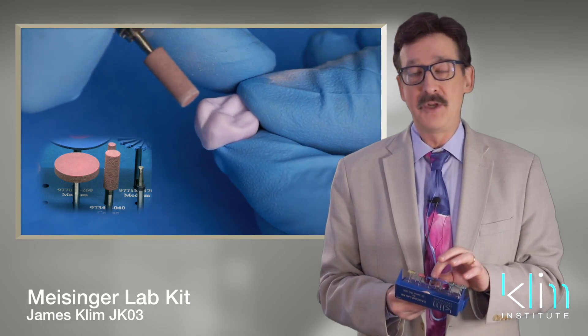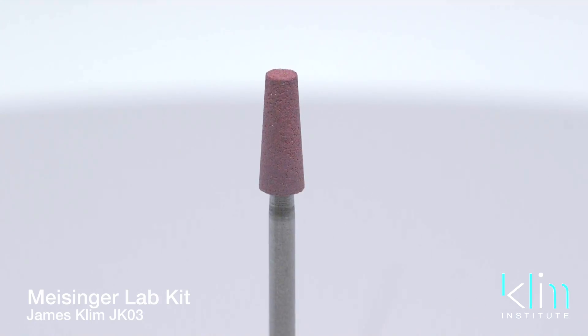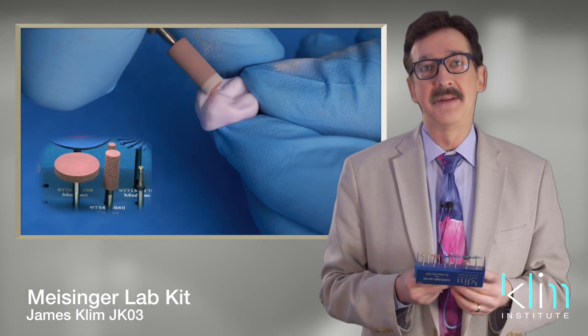There are different shapes available: you have your wheel, you have a cylinder, and then you have a taper — designed for more of a global shaping objective.